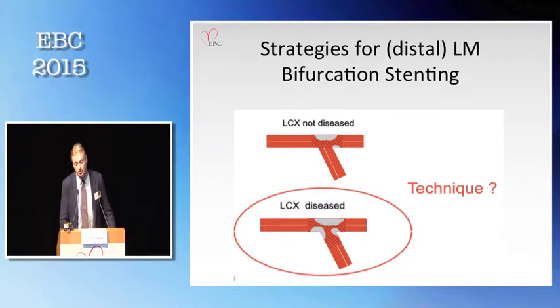And it's not only from this study, we know from old days, and I remember Patrick's data, and so many data coming from the 90s even, there was always a problem with the circ. Of course, it was also with bare metal stents. And there's no question that we should use drug-eluting stents if we go for a two-stent strategy, especially in left main.